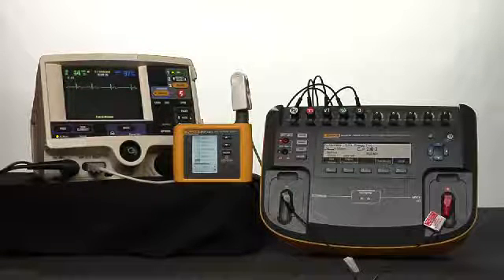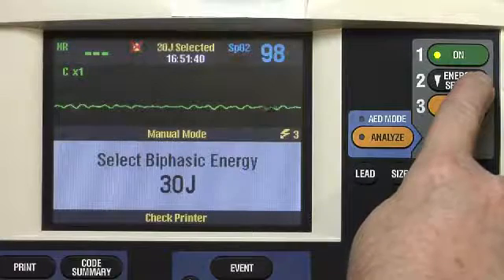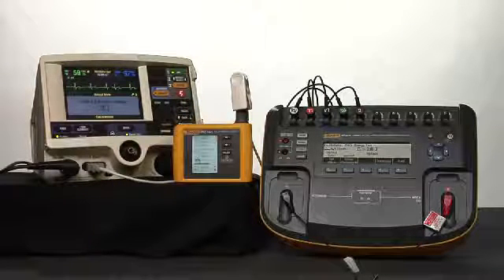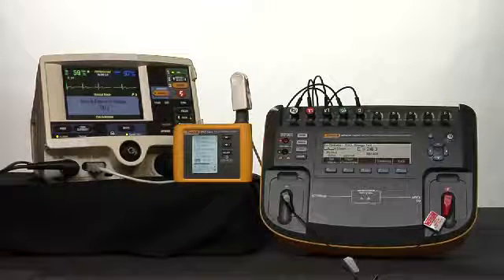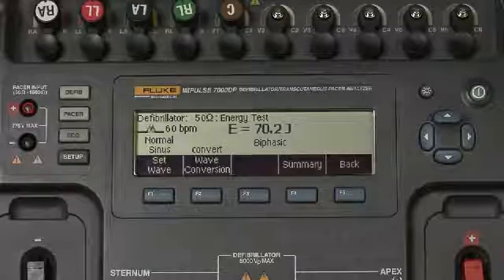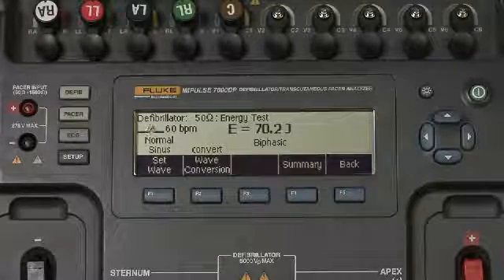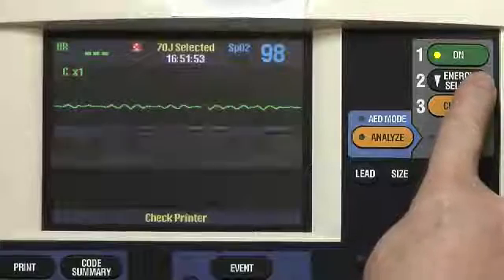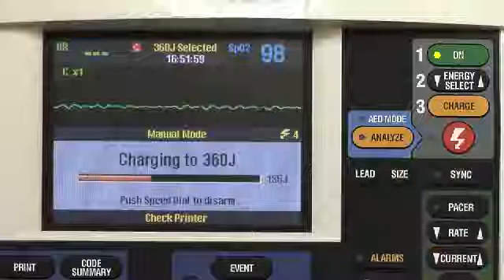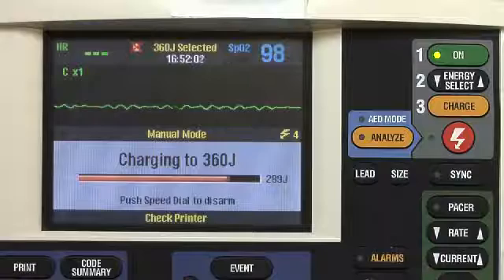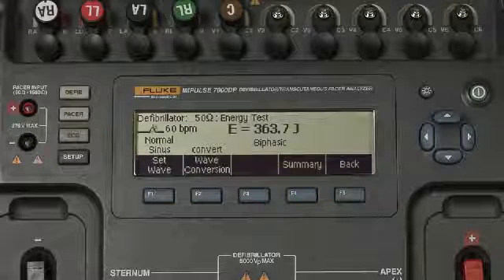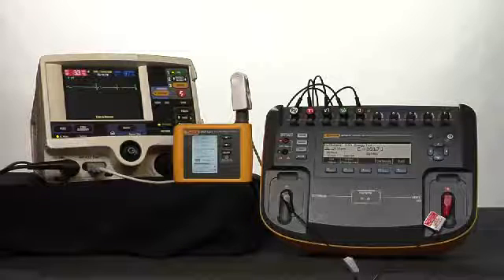Now we want to take the energy level up to 70 joules. Increasing the energy level to 70 joules. The acceptable output at this level is 65.1 to 74.9 joules. Pressing the charge button. Charging. Discharging. 70.2 joules measured. And finally we'll take the device up to 360 joules. Increasing energy to 360 joules. Charging. Discharging. 363.7 joules measured, within the acceptable range of 335 to 385 joules.